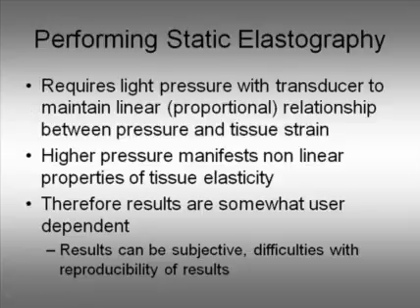If you press too hard, most materials, including breast tissue, will start to manifest nonlinear properties of tissue elasticity. And once you lose that linear proportional relationship, you're not going to be able to easily estimate how hard something is based on how hard you're pressing on it.